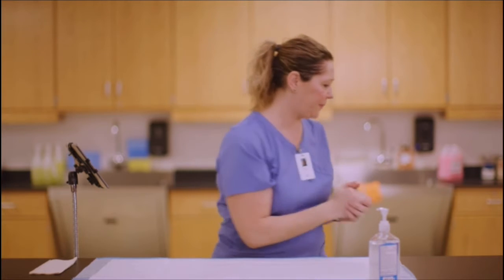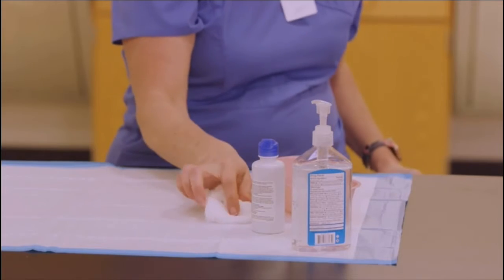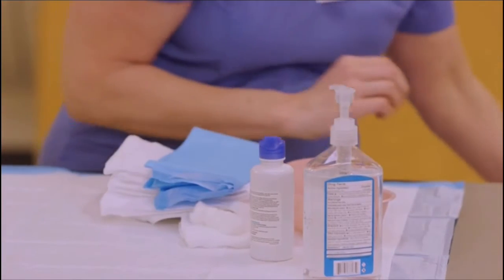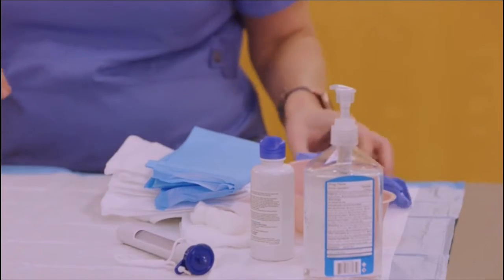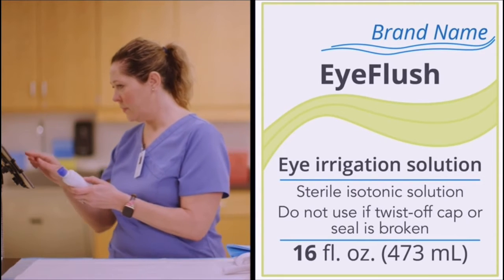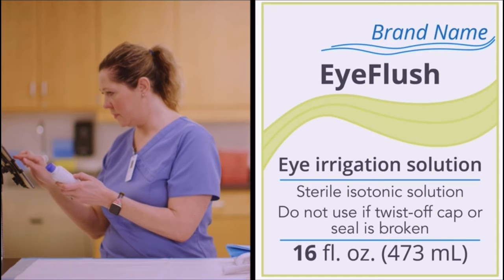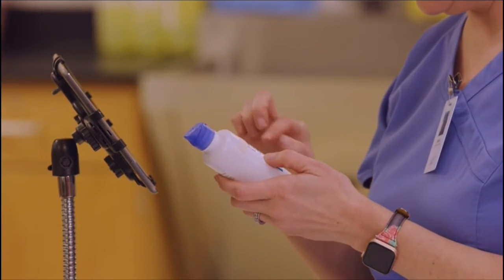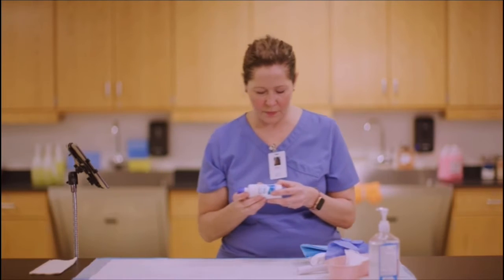Gather additional supplies, including a collection basin for the solution, gauze to use on the patient's eyelids before and after the procedure, a drape to protect the patient's clothing, and a bath thermometer to measure the temperature of the warming solution. The provider will specify the name of the solution, its strength, the time you're to give it, and the route of administration. When retrieving it from the storage area, confirm the information on the solution matches the order. Take an extra step to examine the expiration date.